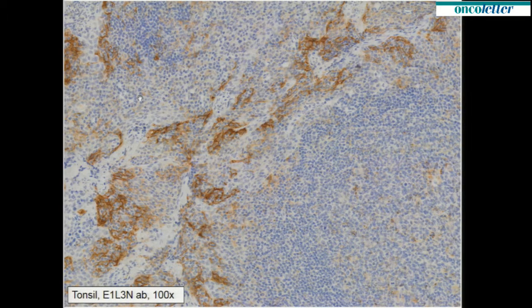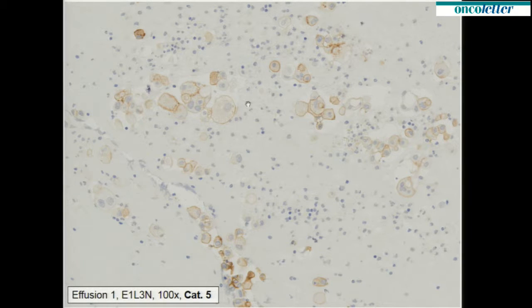But surprisingly, if I take the very same cell block again out 10 months later, it seems that this block somehow has matured over time, like red wine, a little bit. If I do the same antibody from Cell Signaling, actually all of these cells become positive, so it has shifted from category 3 to category 5, just in the archive.